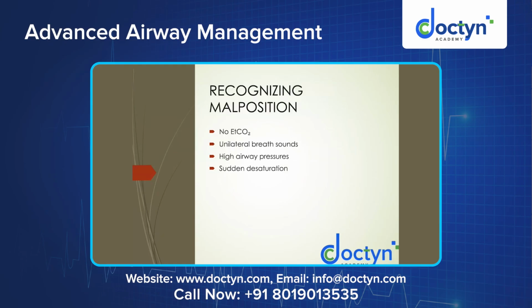As we said, signs like increased airway pressure, sudden desaturation, or unilateral breath sounds would suggest a problem. Why high airway pressure? Because the tube has gone too deep. Once the tube has gone deep, the tidal volume that should go to 2 lungs is being provided to 1 lung. That's why the airway pressure increases. So that is one sign that the tube is slightly not at the right position above the carina.